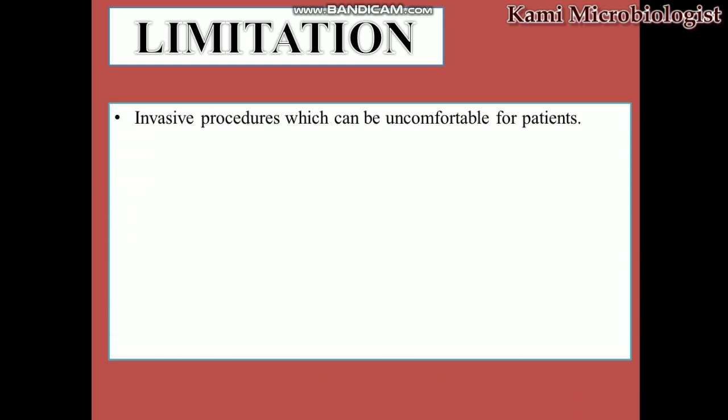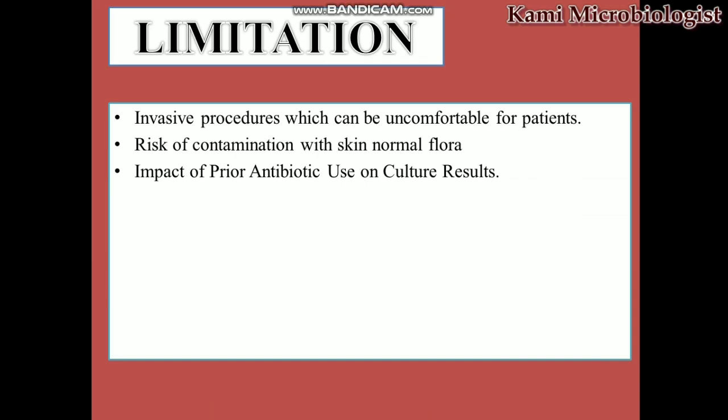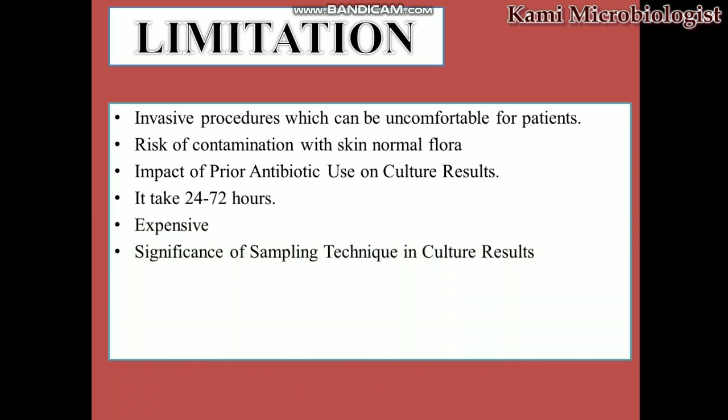Limitations: in this test the patient feels uncomfortable. In this test contamination may also occur due to the skin normal flora. If the patient is using antibiotics, the culture test will be negative, and it can generate a negative result due to bacterial growth suppression by antibiotics. It takes 24 to 72 hours, which is a long time. It is an expensive method. It requires special techniques.